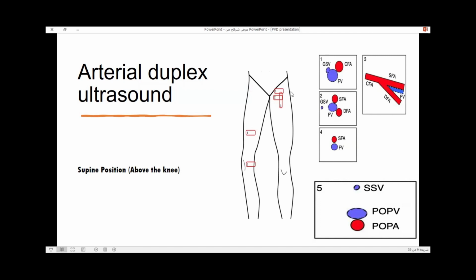So we can see the artery in longitudinal as a Y-shape, while the deep femoral is deeper than the superficial. We can assess in those images with Doppler or grayscale. For the popliteal artery, we can evaluate it while the patient is in supine position, but it is usually better to go prone. In supine position, we have to abduct the knee joint and evaluate it in the posterior medial portion. We can also see the small saphenous vein in the same image.